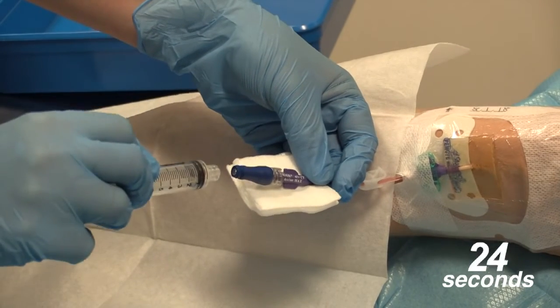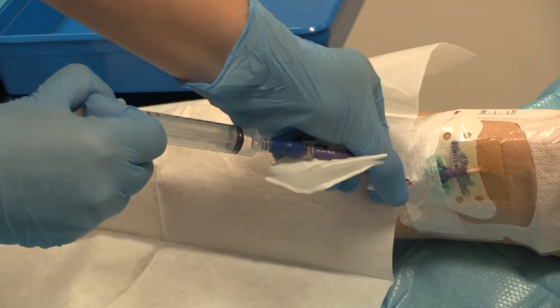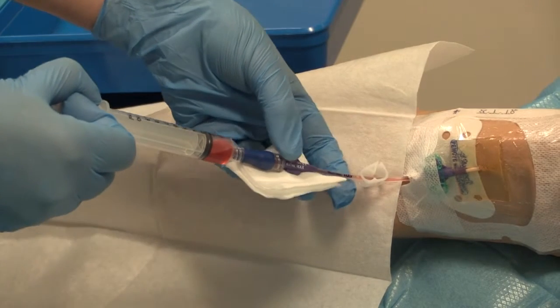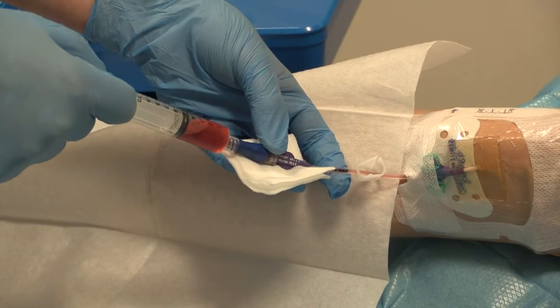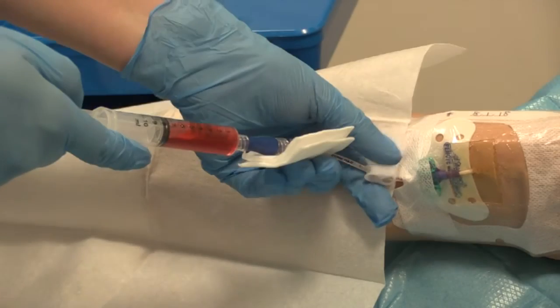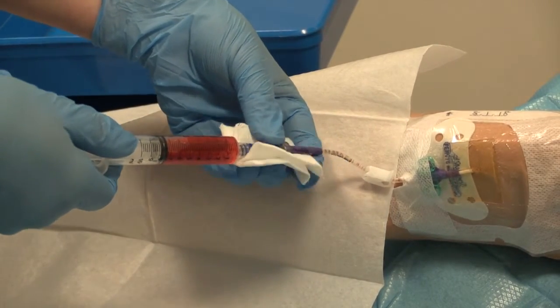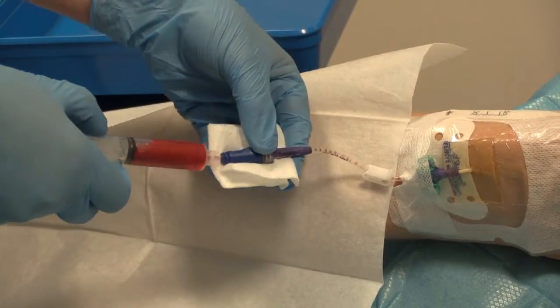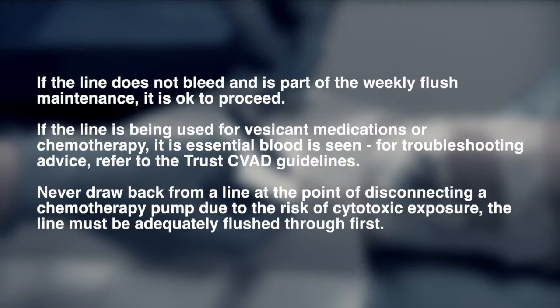With one hand using the gauze, hold from underneath avoiding the key parts. Taking the empty 10ml Luer lock syringe, attach to the needle-free valve and apply some suction before unclamping the line, drawing back about 5ml of blood. While still withdrawing the last few mils of blood, re-clamp the line. This blood can be discarded as per trust and IPC policy, unless required for line sepsis and sent for blood cultures. If the line does not bleed back and this is part of weekly flush maintenance, it is okay to proceed.